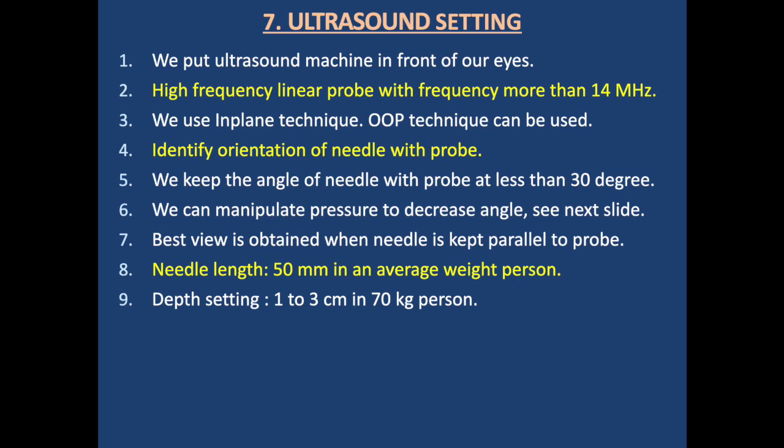We can manipulate pressure to decrease angle, and this is described in the next slide, how we apply pressure on one side to have a better angle and better visualization. Best views are obtained when the needle is parallel to the probe. Required needle length is 50 millimeter in an average person.